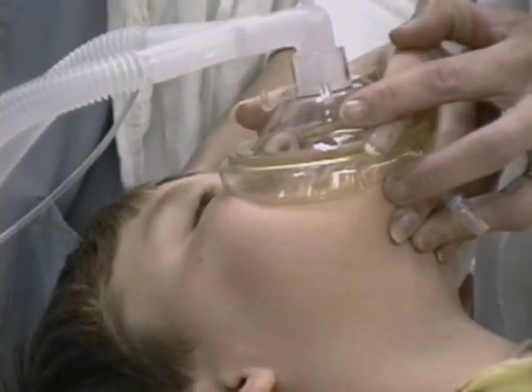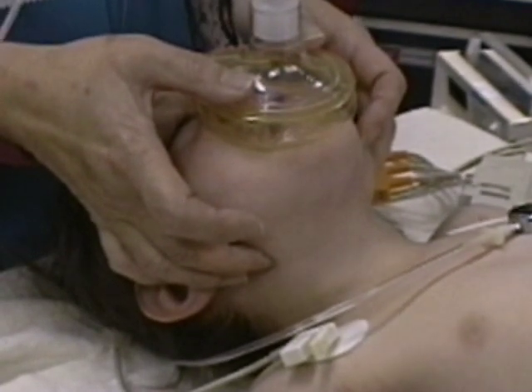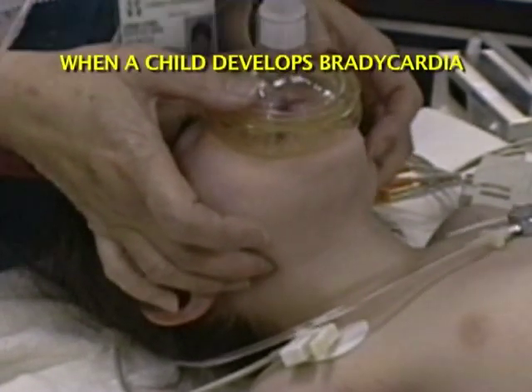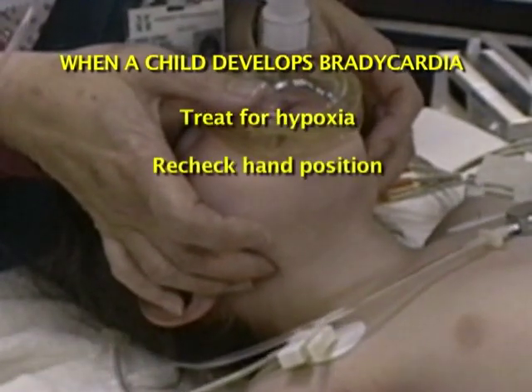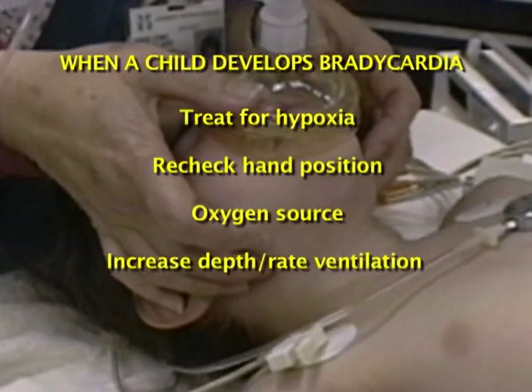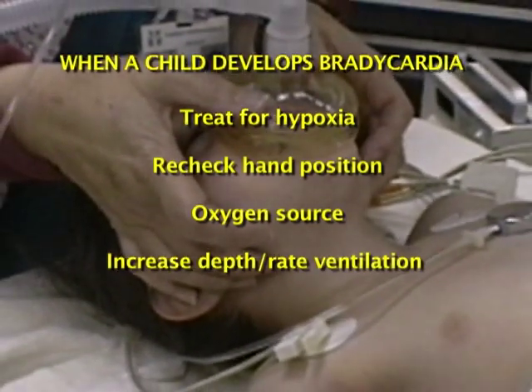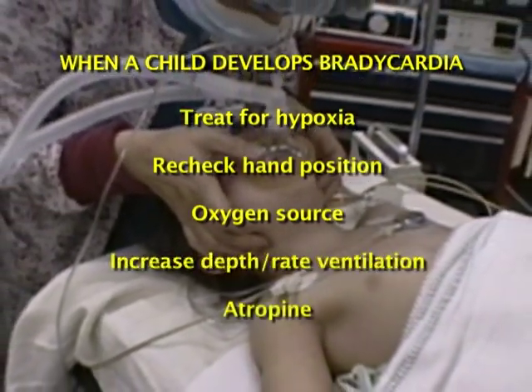Hypoxemia rapidly causes bradycardia in children. When a child develops bradycardia, treat for hypoxia first. Recheck your hand position and oxygen source. Increase the depth and rate of ventilation. The heart rate usually returns to normal quickly, although atropine may also be needed.